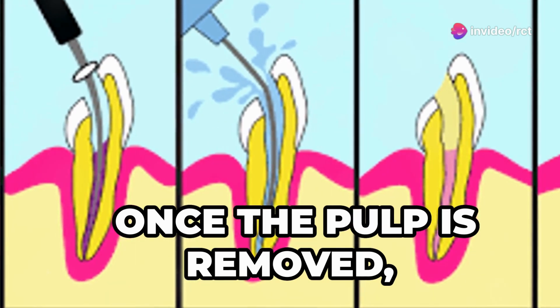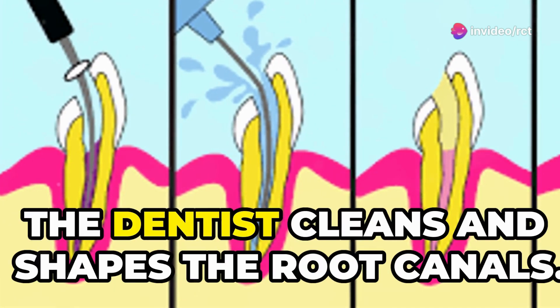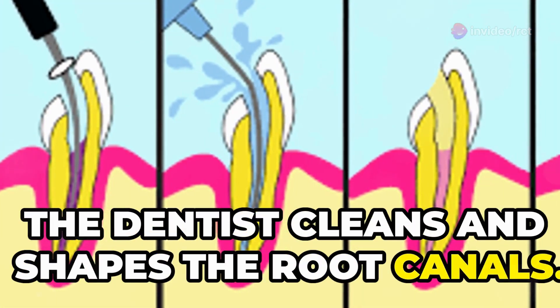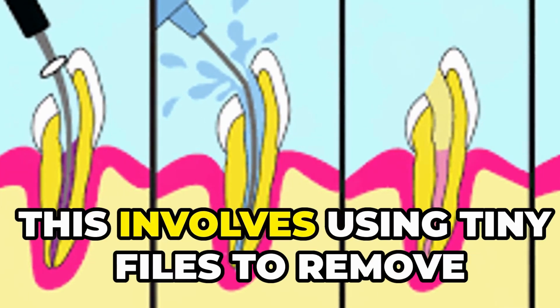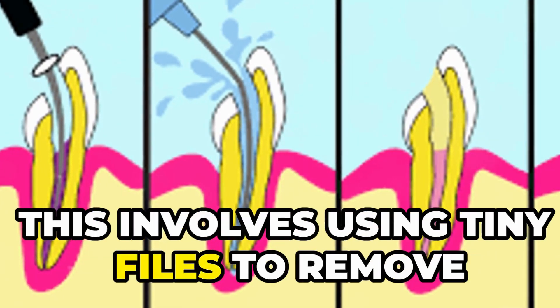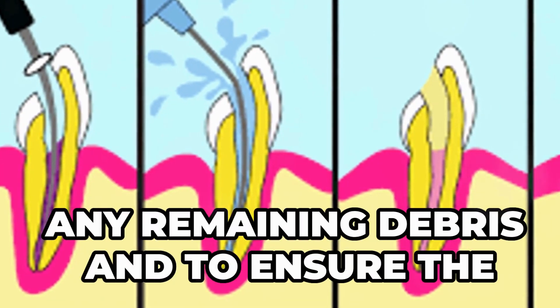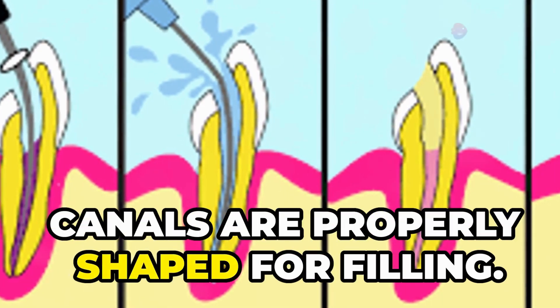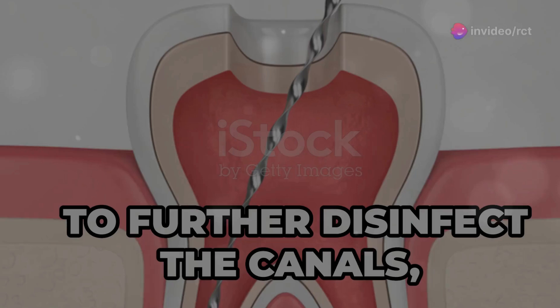Once the pulp is removed, the dentist cleans and shapes the root canals. This involves using tiny files to remove any remaining debris and to ensure the canals are properly shaped for filling.